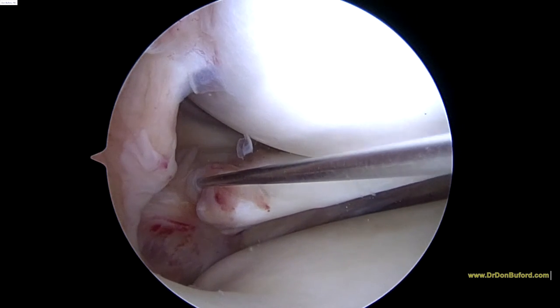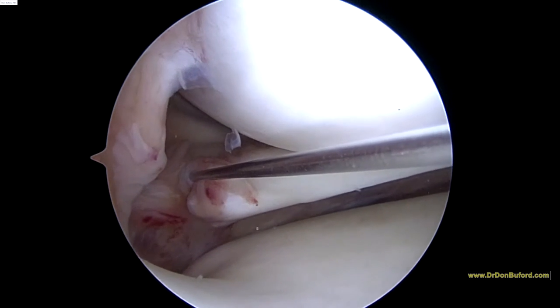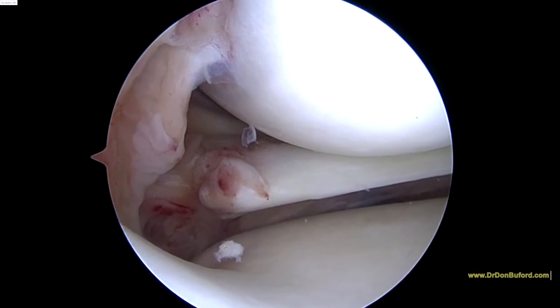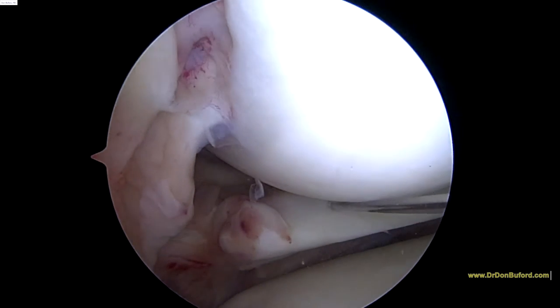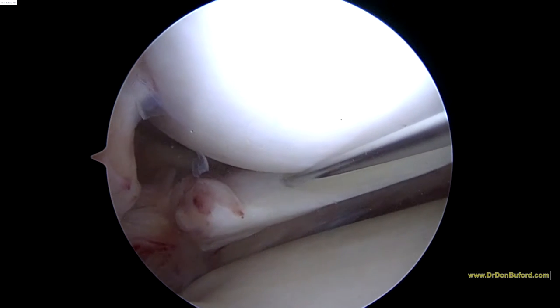Now we're going to move the needle and inject another location. So now you can see we've got the needle going through the meniscus right where the tear is. We're going to inject another half cc here.